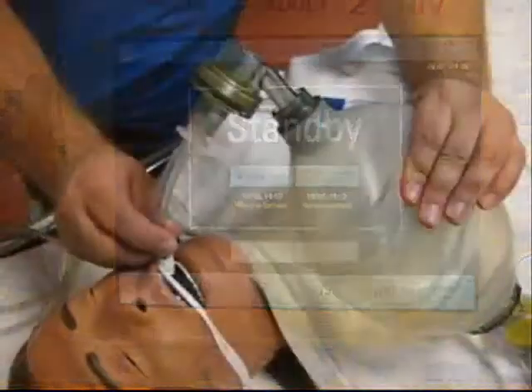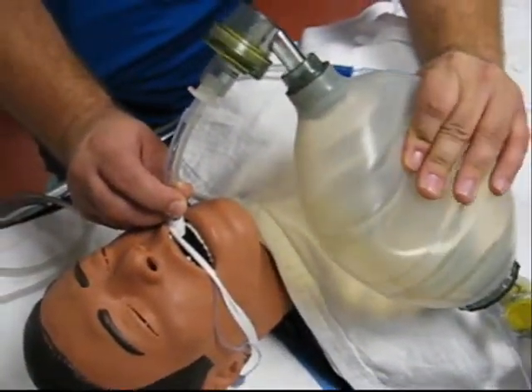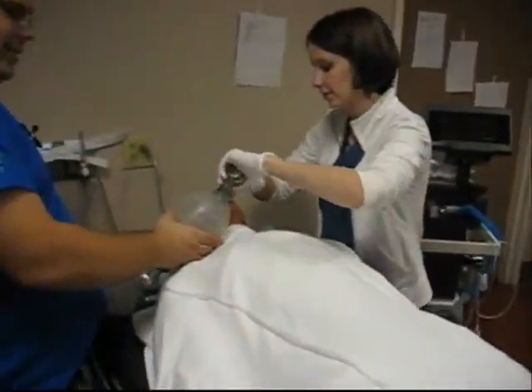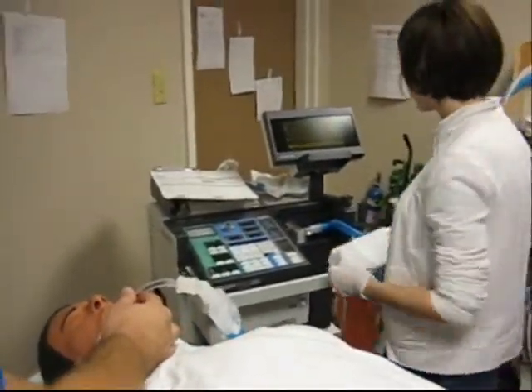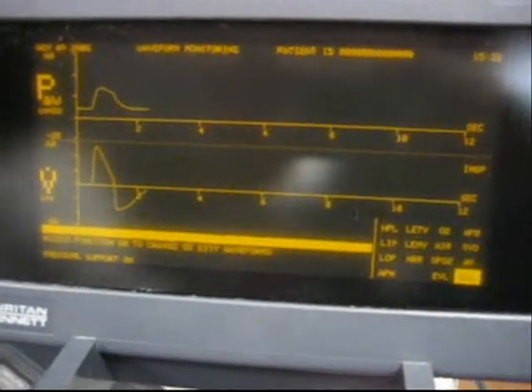Mechanical ventilator initiation starts with the patient being manually ventilated. Ensure that the mechanical ventilator has been turned on, and then simply attach the interface of the circuit and the endotracheal tube together, and quickly observe for chest rise, the development of pressure and/or volume in the mechanical ventilator circuit.